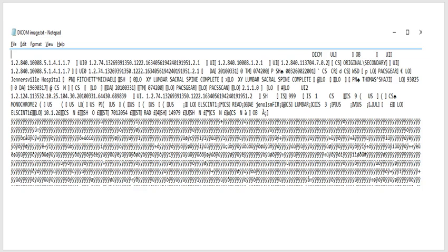This is the image file for that image. From here down to here you have something called the DICOM header — this is information about that image. Down here where you see all these crazy characters, this is the actual image itself: the ones and zeros that turn into the actual grayscale image.